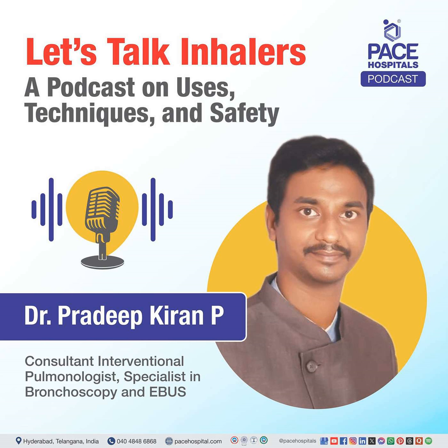Let's start by understanding what are inhalers. Hello everyone, I am Dr. Pradeep Kiran. I am working as an interventional pulmonologist at Pace Hospital, High-Tech City. Today we are going to discuss one of the most commonly used medications in the field of pulmonary medicine, which are inhalers. An inhaler is a device which is used to deliver a particular amount of drug into the airways directly, either in the form of droplets or powder form.